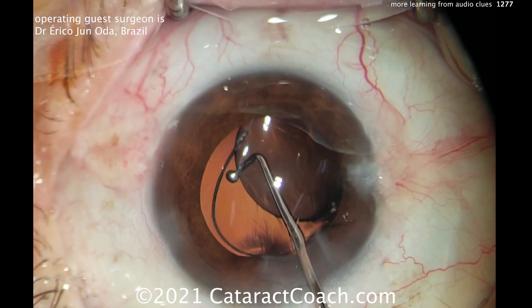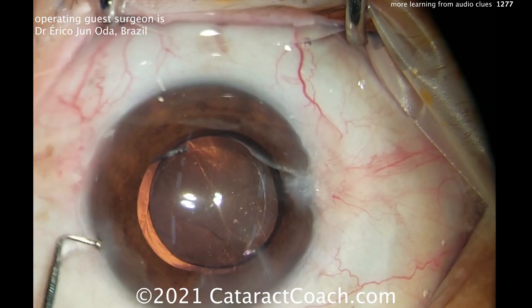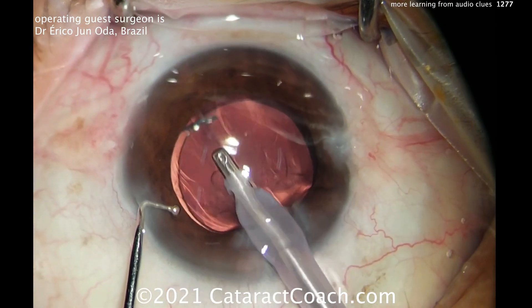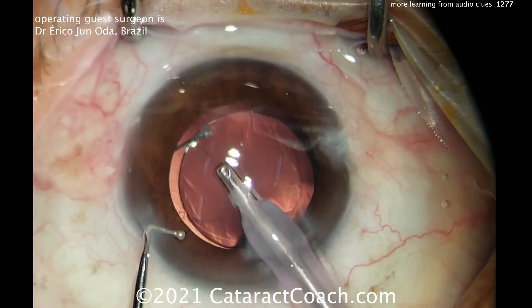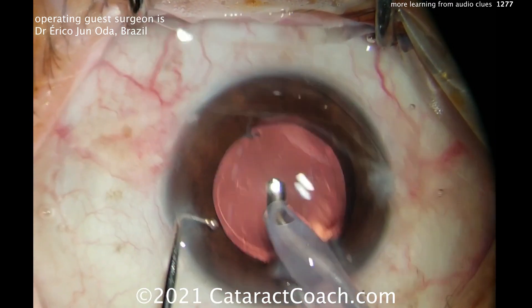At the end here for viscoelastic removal, you're going to have very high vacuum. So listen to the sound now — it's going to be very high vacuum. There's the IA probe, and as you step through the pedal more and more, you're going to hear higher and higher vacuum levels.